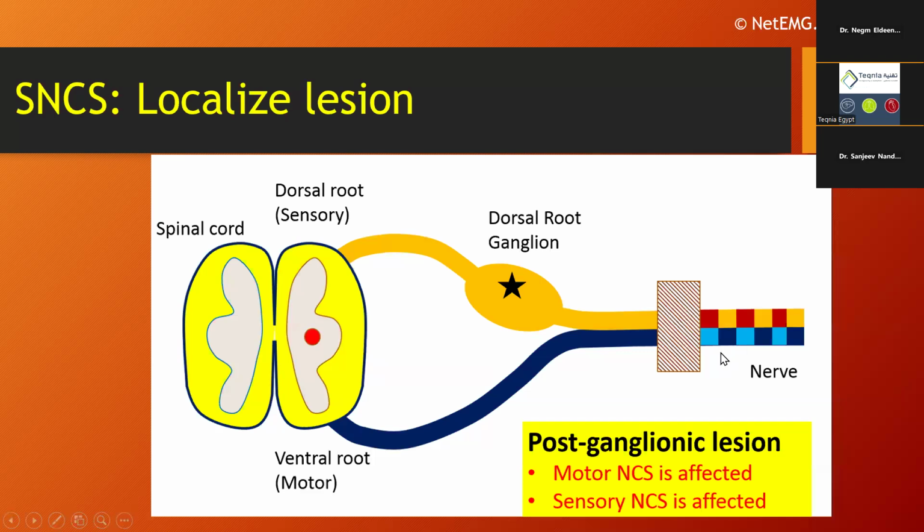Sensory nerve conduction studies tend to be a little bit more challenging because of low amplitude, but I like them because they are useful not only for localization, but they are also more sensitive, for example, to study demyelination. I think because they do not involve the neuromuscular transmission, we can purely assess the speed of conduction, which is a little bit more challenging in motor. And I think that's why sensories are more sensitive in polyneuropathies compared to motor. Again, that's my hypothesis at the moment.